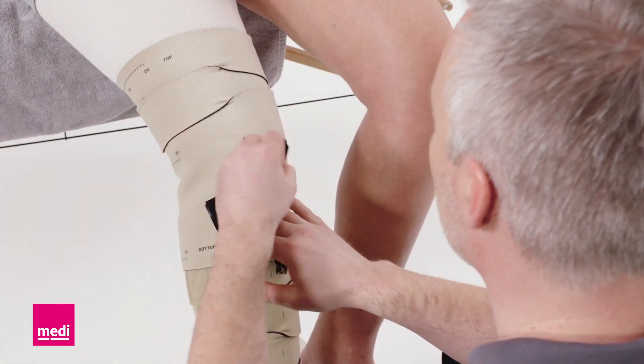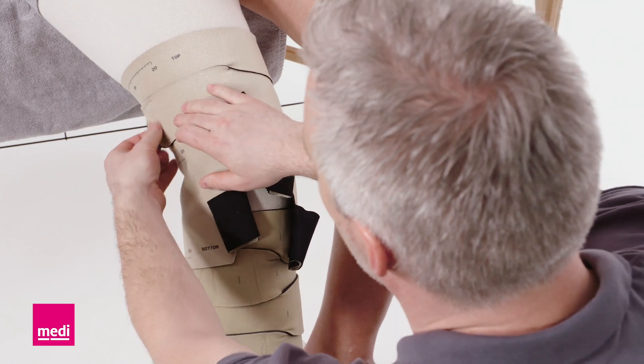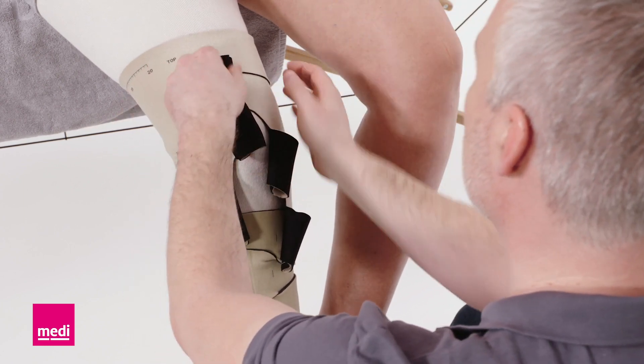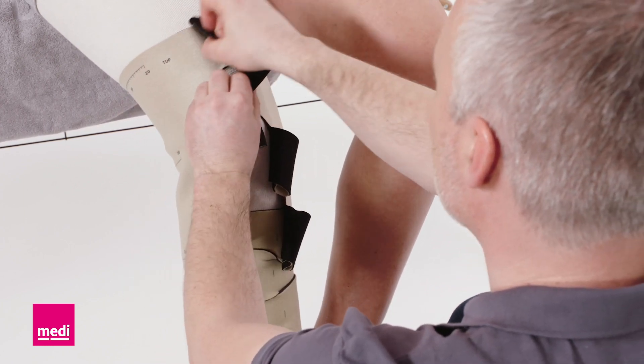Roll back the bands to keep the hook fasteners lint-free.